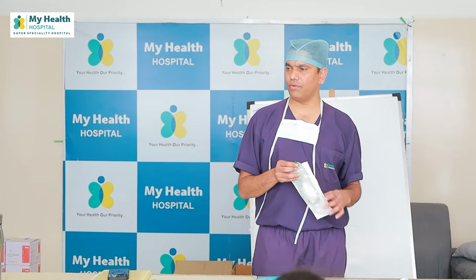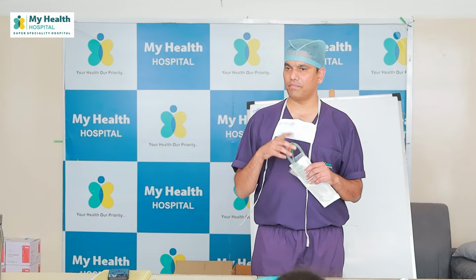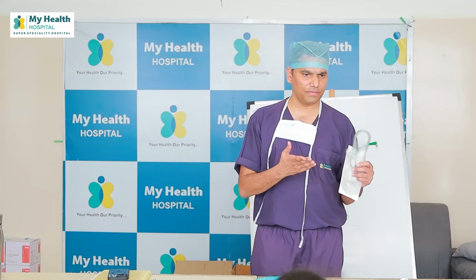90% of us, what we do, we will place a Ryle's tube. One more indication is before CPAP, we insert a Ryle's tube. Why do we use it before using CPAP in the ICU?